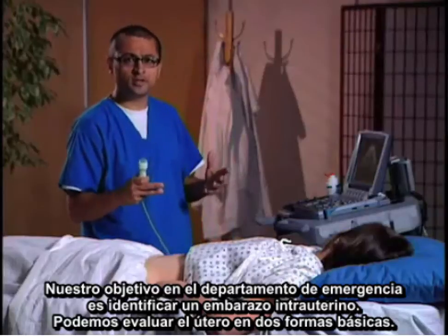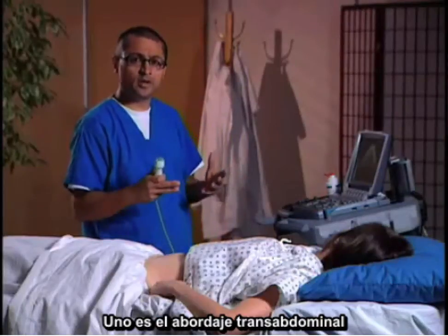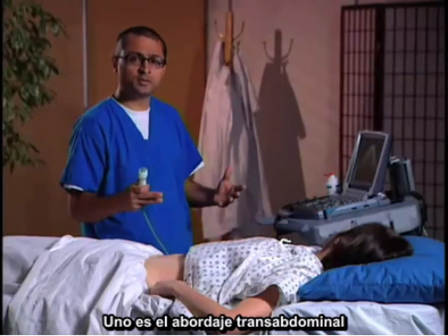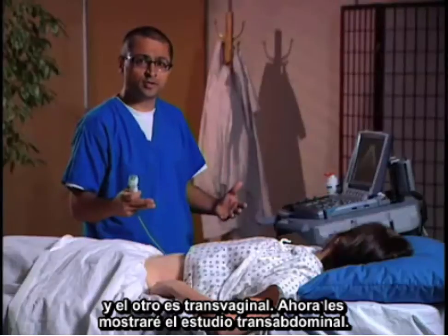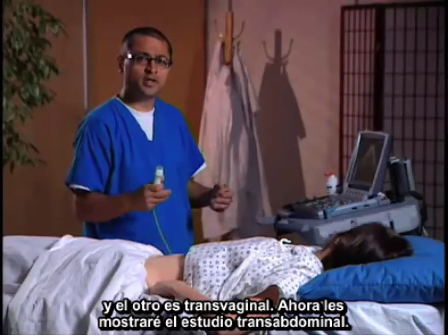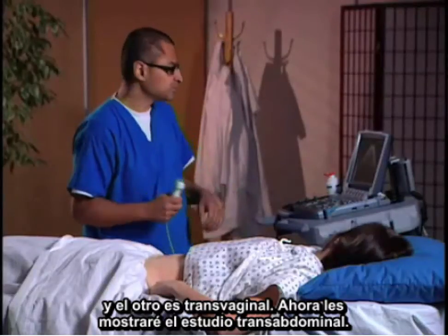We can evaluate the uterus in two basic ways: a transabdominal approach and a transvaginal approach. Right now, I'm going to show you the transabdominal approach.